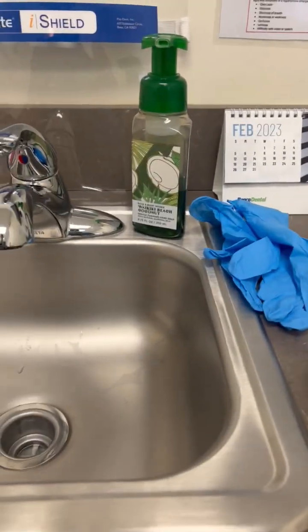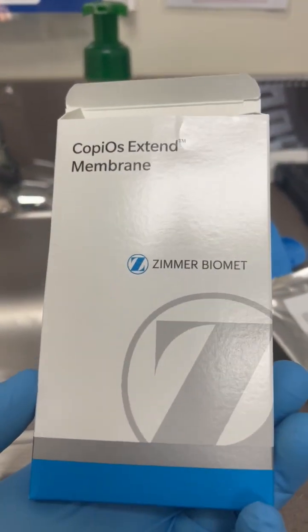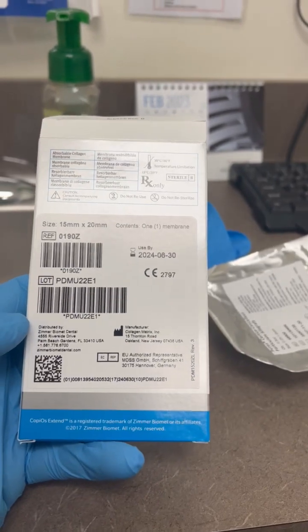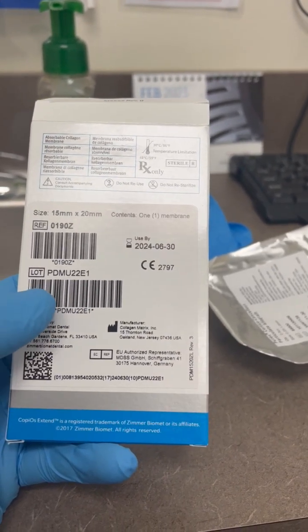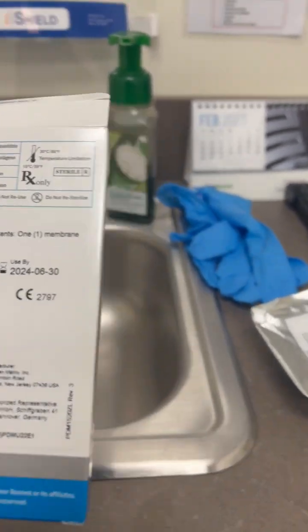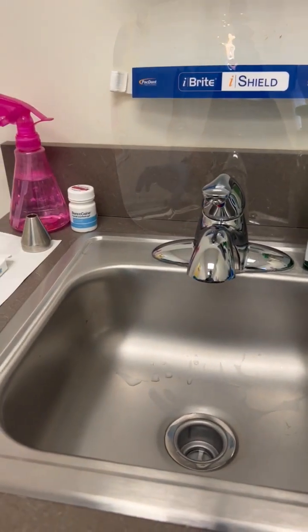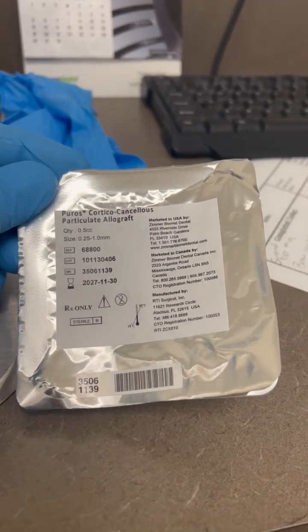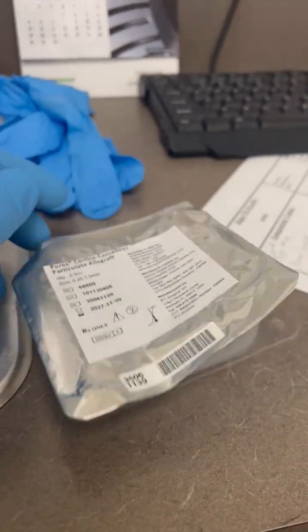And then the membrane that we use here is a Copious Extend membrane, both by Zimmer Biomet. So you're going to see this here. This has a reference number and a lot number. We want to make sure we put that in the chart, both for the membrane. The membrane's bovine typically, and the cadaver bone here also has a reference number and lot number that needs to be put in the chart.